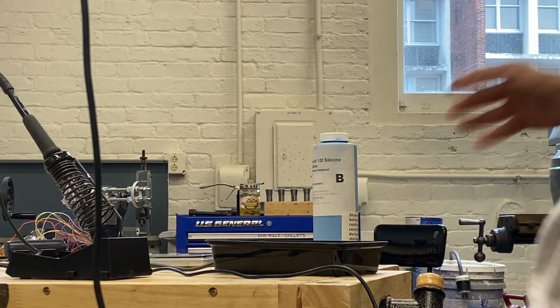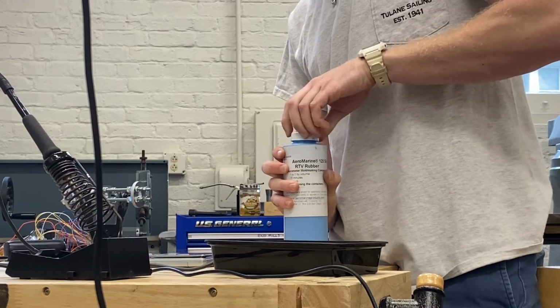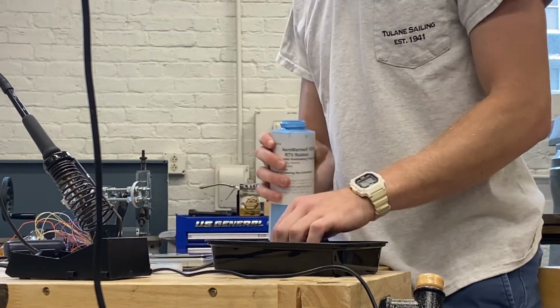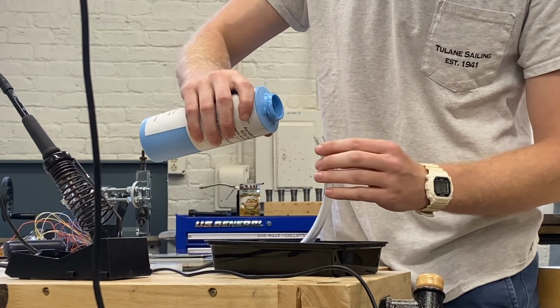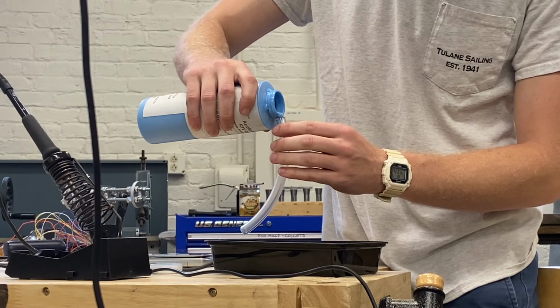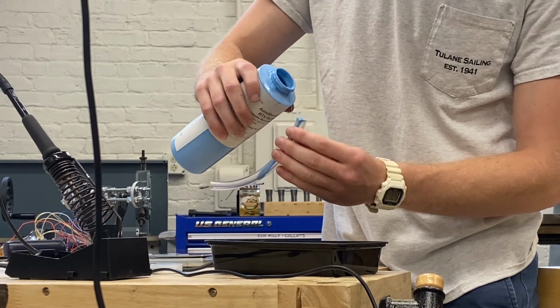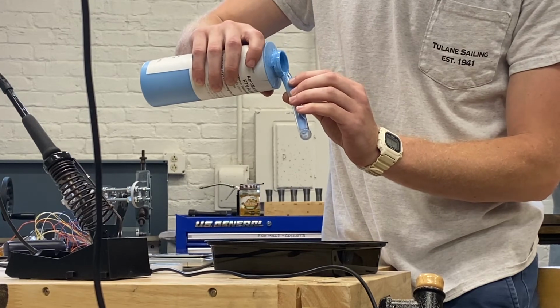Finally, we wanted to compare our various design iterations, so we performed tests on tip 3, tip 4, and tip 5. 10mm diameter soft PVC tubing was cut into 6-inch sections in order to fit the new test rig. These sections of tubing would represent a section of an endotracheal tube. Each of the tubes was weighed in order to determine percent removal later.